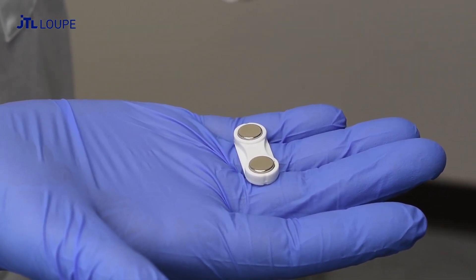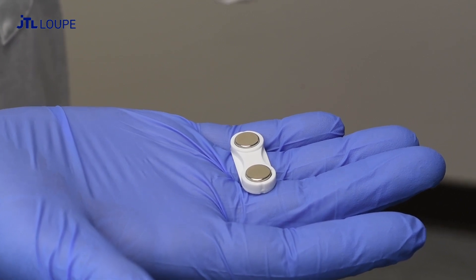Attach the battery to your clothing with the included magnet. We recommend placing it near the top of your shoulder.